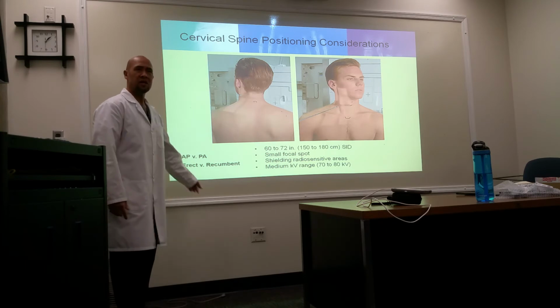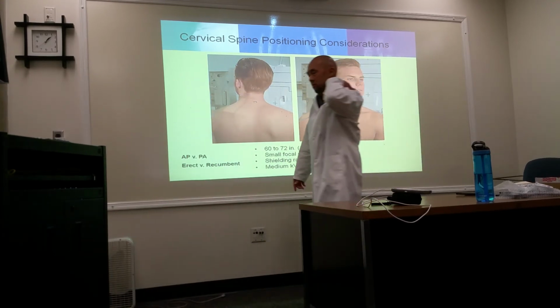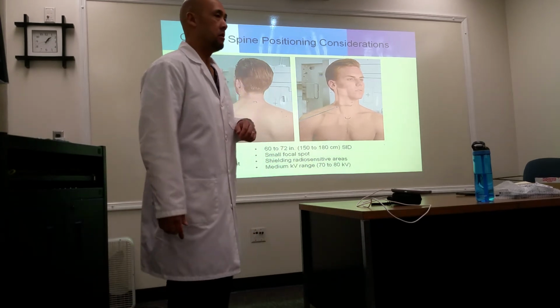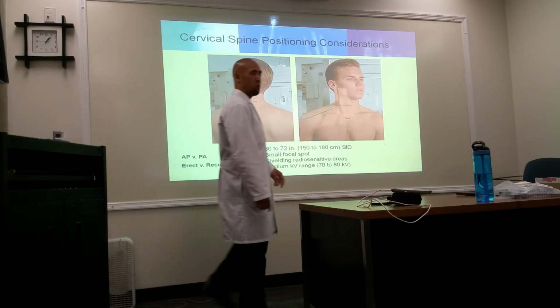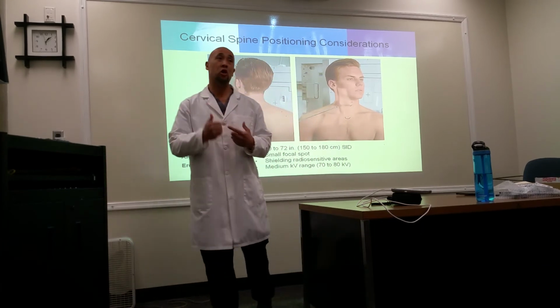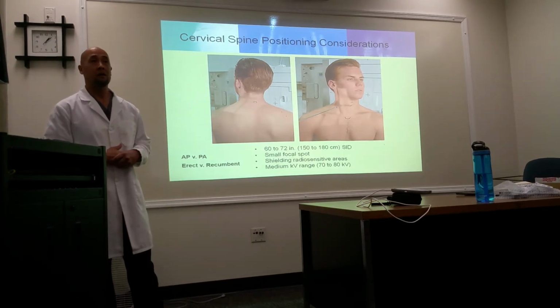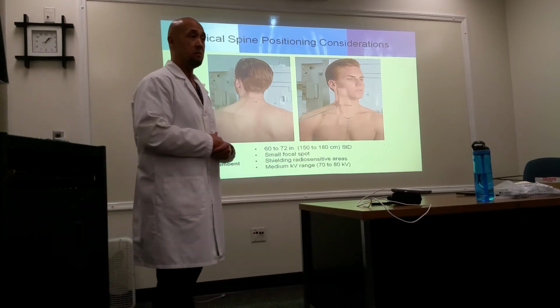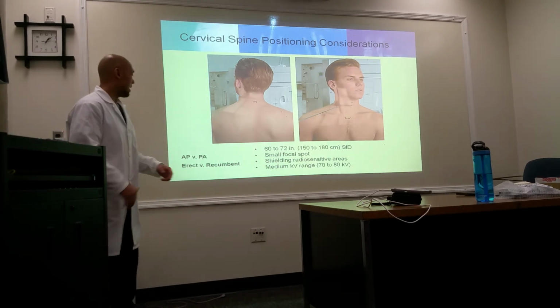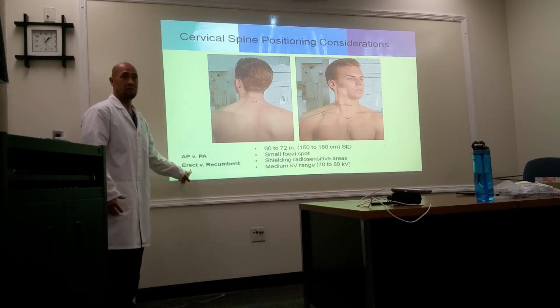Okay? Erect versus recumbent. You guys have this on your slide. It is best to do the vertebral column in an upright position. In an erect position, we can see better alignment because of the weight that's bearing down on the spine. And you can see any type of pathology that may be occurring in between the bodies, like intervertebral conditions like herniated discs. So it helps us evaluate the joint spaces a little bit better. You really can't get that out of recumbent. But if you have a trauma patient, which would be the better view? Recumbent. If they can walk, if they can talk, upright is the best way to do it.